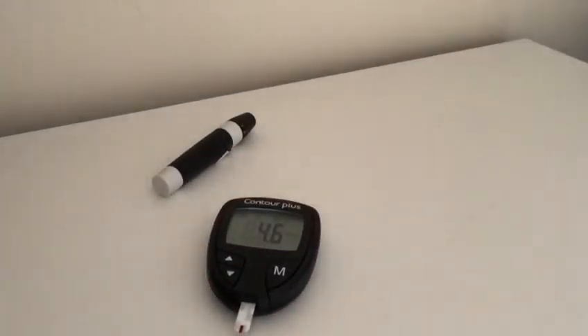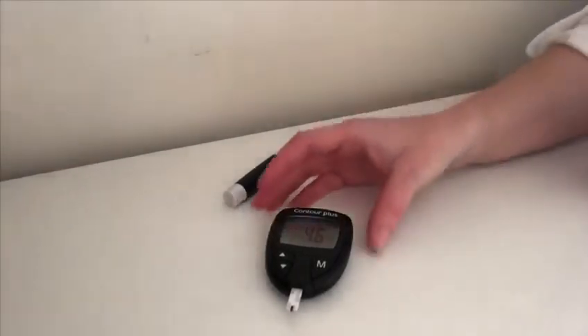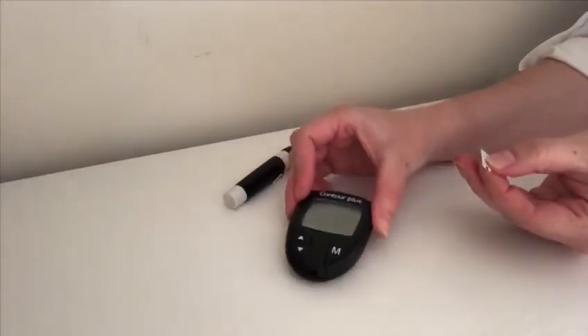In five seconds it will give you a result. The result will be in millimoles per litre. To remove the used test strip, pull it out of the bottom of the meter and this will turn the meter off.